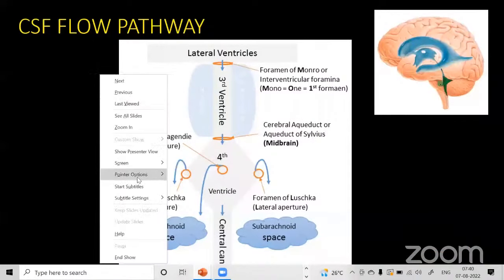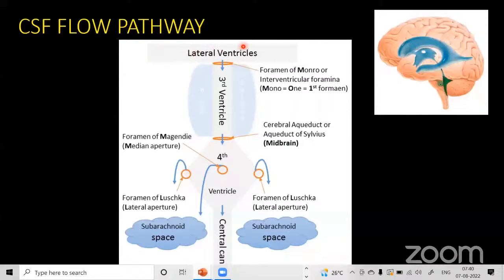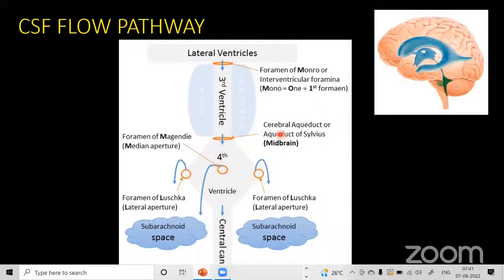CSF is produced mainly through the choroid plexus and flows from the lateral ventricles into the third ventricle via the foramen of Monro. From the third ventricle, via the aqueduct of Sylvius, the CSF flows into the fourth ventricle as seen on the midsagittal view. This is the site where we plan CSF velocity analysis studies, which we will see in a few slides.